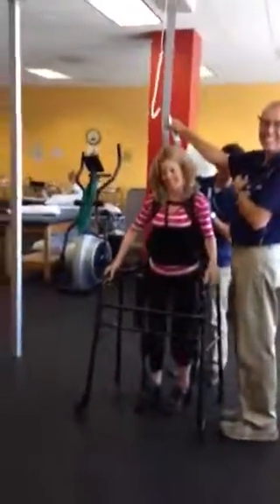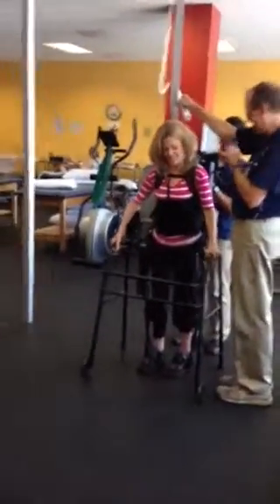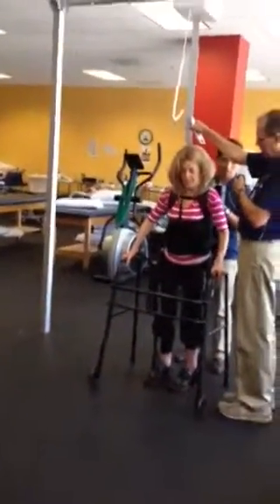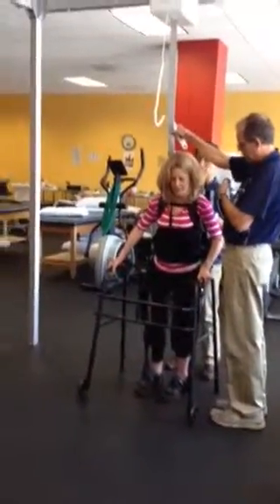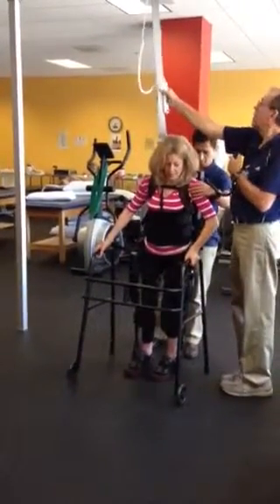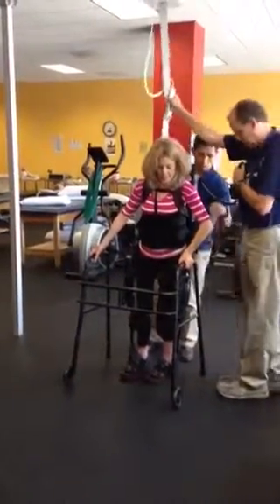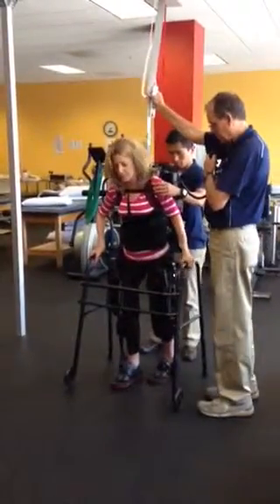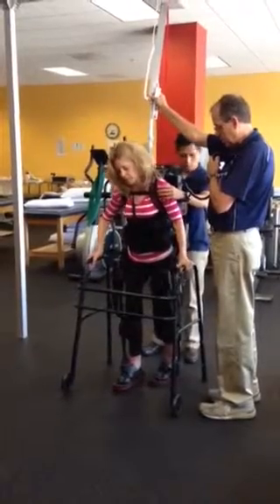I think you can walk back and then I can turn it off. That's fair. You're going to hold for a walk — that's going to beep and then tell me when to push it. Which way am I leaning? Whenever we stop like this, when you start, it's always like step. So you always want to lean back. Just get to walk. I'm going to step. Walk her first. A little more.